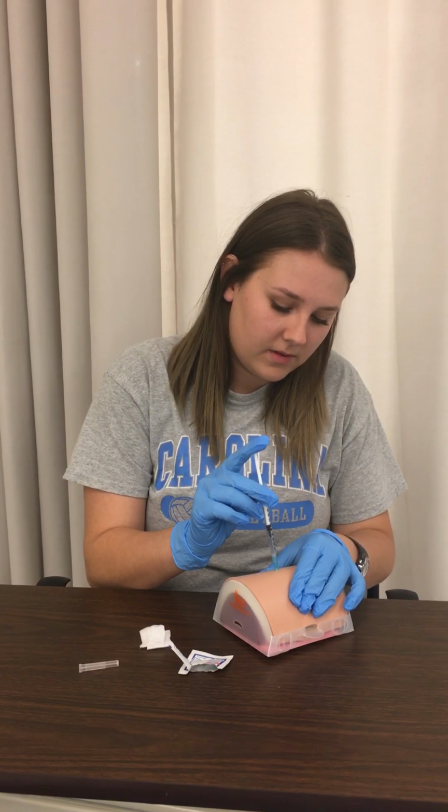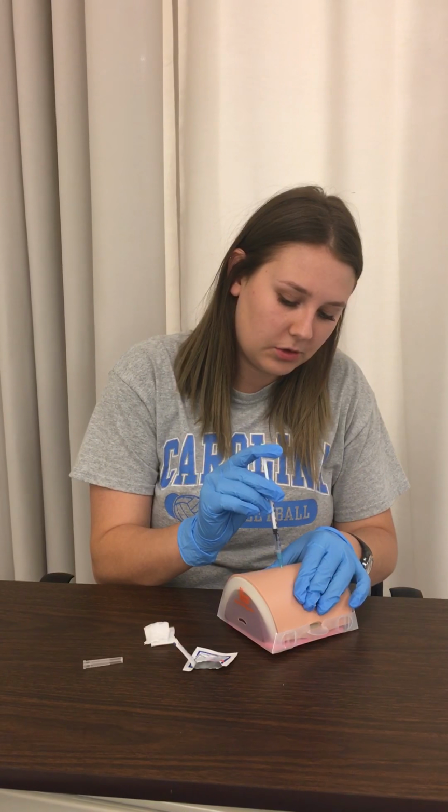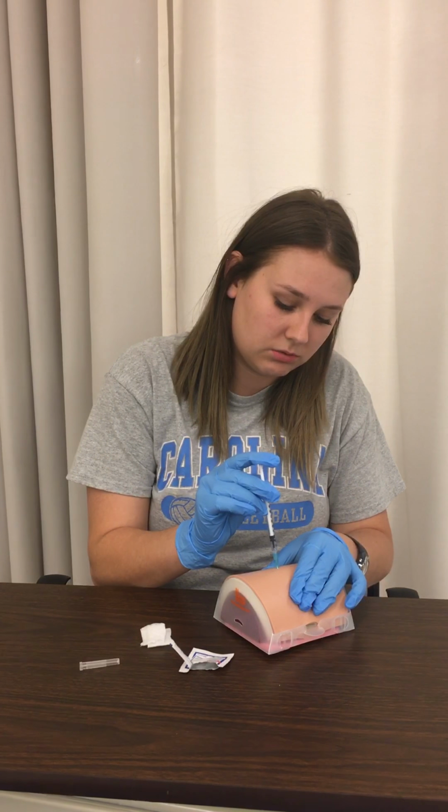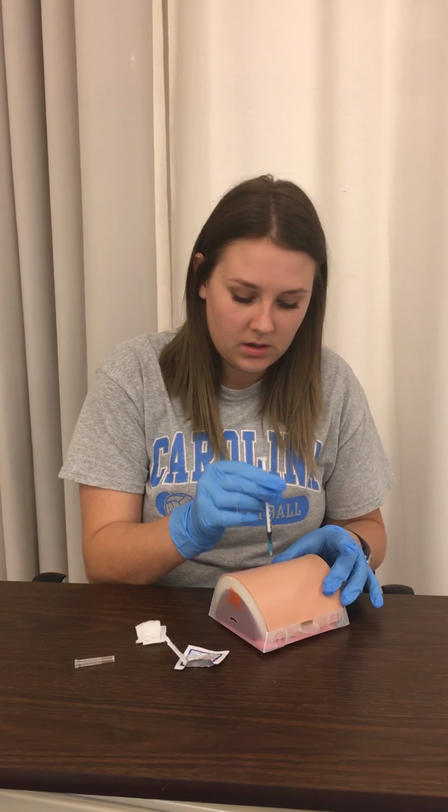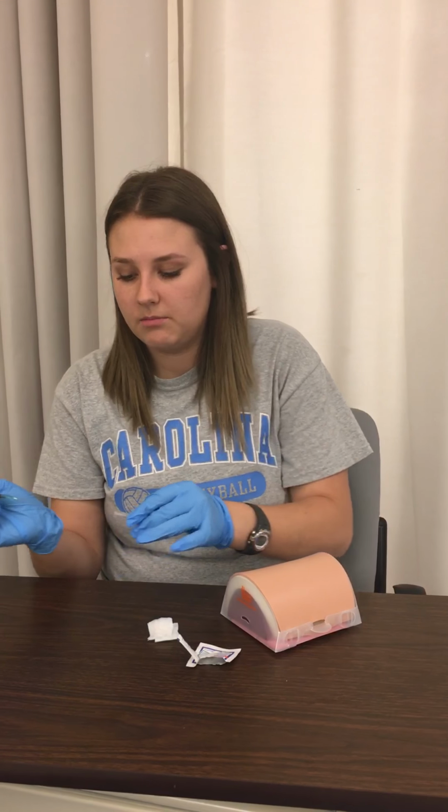You're going to want to give medication kind of slowly. You don't want to push it all at once. And you do not want to rub the area afterwards. Alrighty. Withdraw. And then you're going to cap that needle however the needle is, and then you're going to put that in the sharps. Okay, you're going to assess the area, you're going to assess the patient, ask them how they're feeling, and then you are going to take your gloves off.